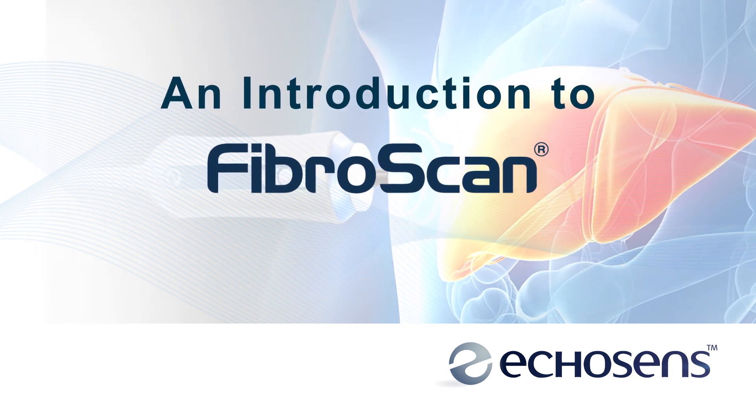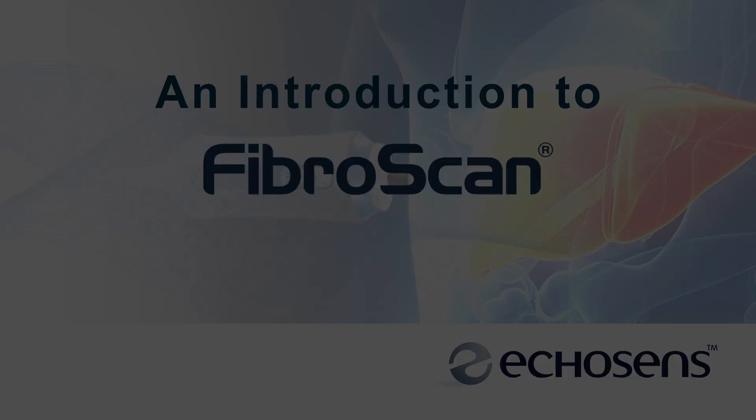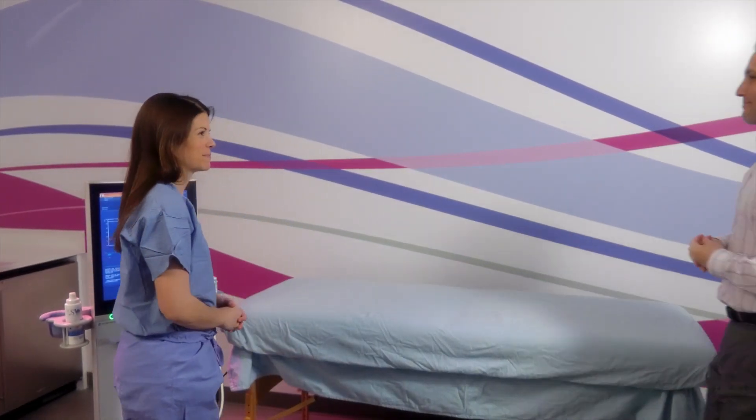The following is a demonstration and explanation of what you can expect to experience during a FibroScan examination.